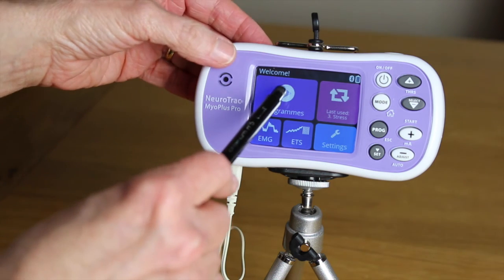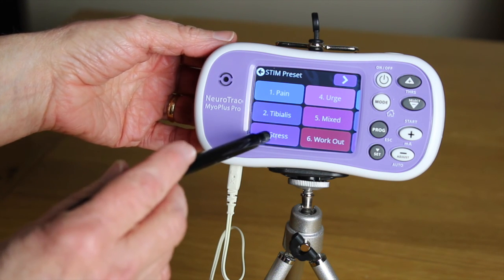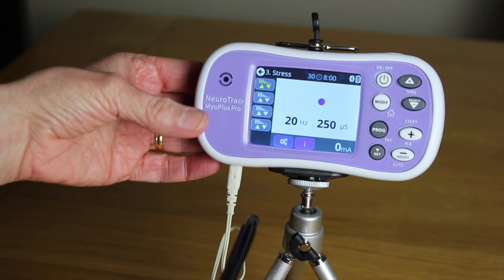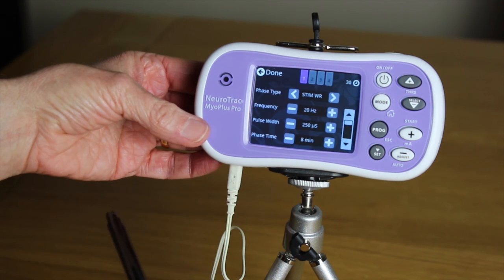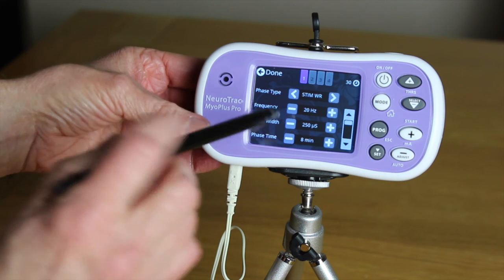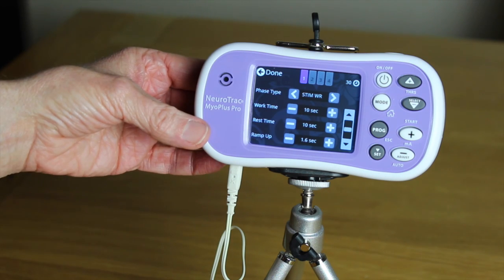Switching the unit on takes you to the welcome screen. Press the program button and you can see some of the various presets for different conditions. Let's focus on preset three: stress. The first phase is highlighted in yellow. You can view the specific details of each phase by pressing the icon at the bottom of the screen. Here we have access to information such as the frequency, pulse width, total phase time, and that the muscle will receive stimulation for 10 seconds and then rest for 10 seconds.